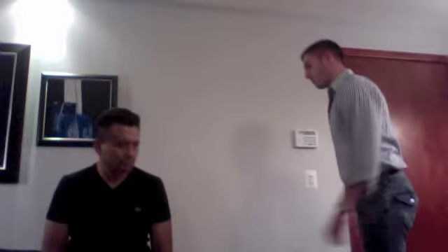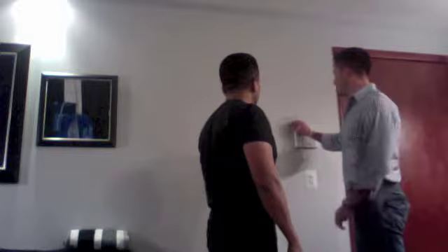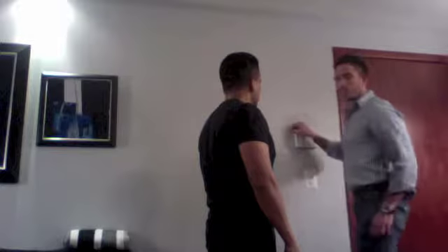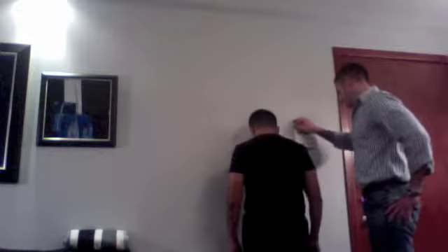Alright, so now we're going to check the patient's height and weight. So first you want to have the patient come over and step up. Before they step on the scale, you make sure the scale is calibrated, so you want to make sure that the line is already parallel. We already calibrated before this, so it's parallel. Then ask the patient to step on the scale, facing towards the wall.